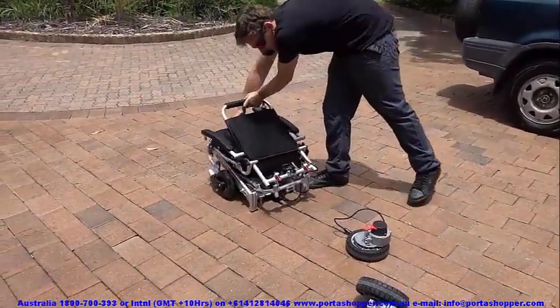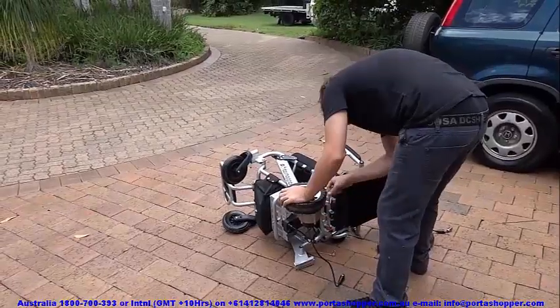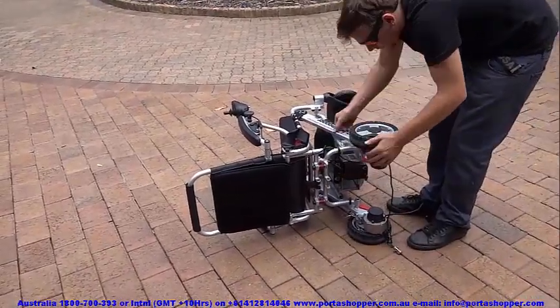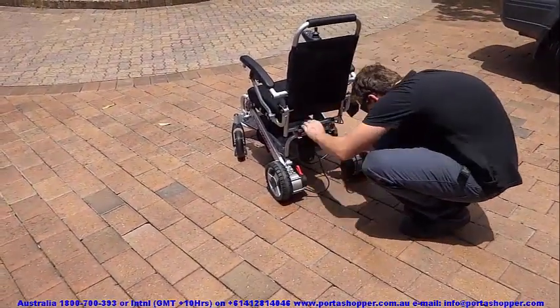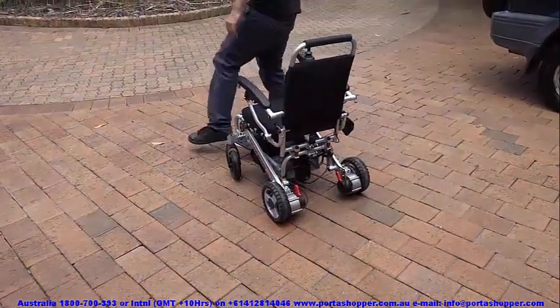The PortaShopper 3 can be chosen with a factory fitted Big Easy quick release kit, or purchased with the option of getting a retrofit kit at a later stage. It is also compatible with all our accessories including the Big Easy Kit, the air glide suspension casters, our adjustable angle leg rests, the stand sticks, the carer control arm, and the PortaRamp.